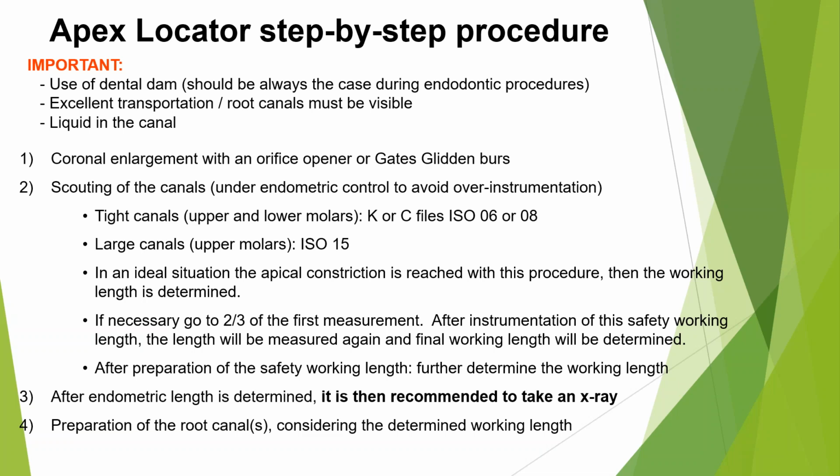You hear Gray talk about it as well. He doesn't know any endodontists, or he thinks GPs are crazy if they're not using dental dam, because it helps prevent contamination, helps visibility, and then it helps keep everything isolated.